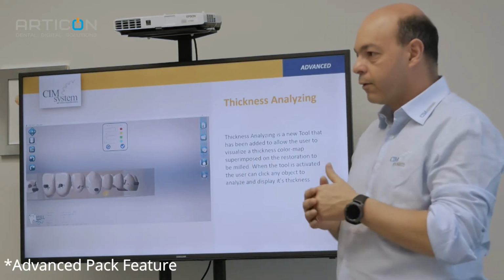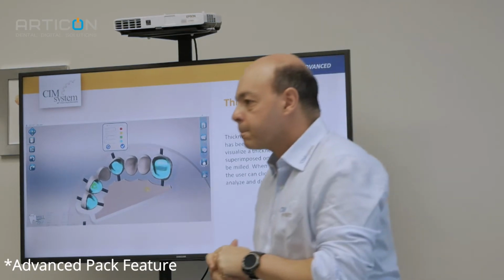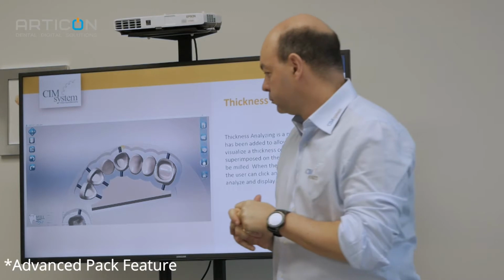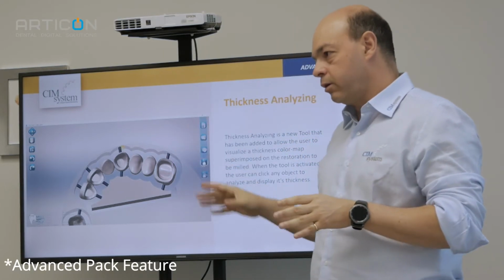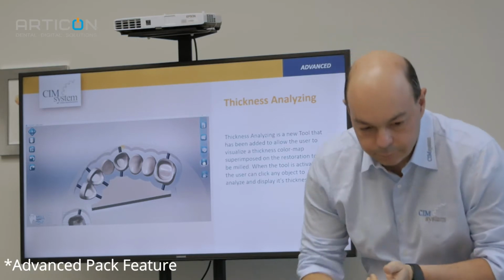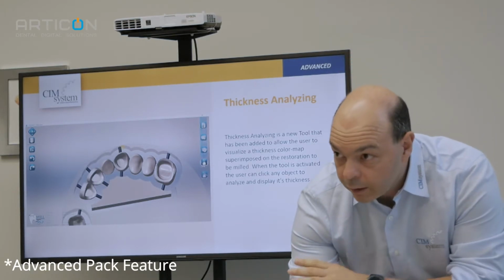Is this feature going to be in the next upgrade? Yes. All this function is in the next update. Okay. This is very nice.